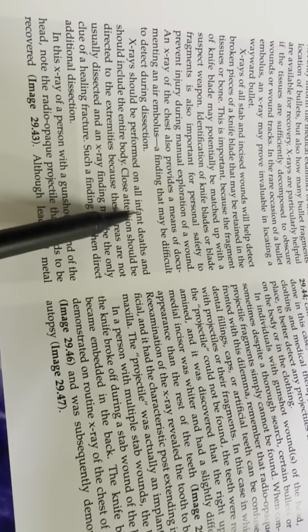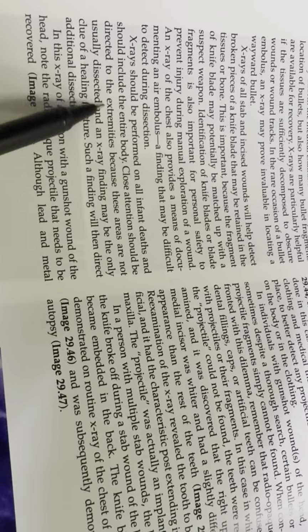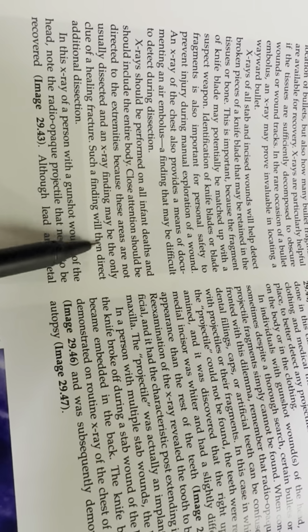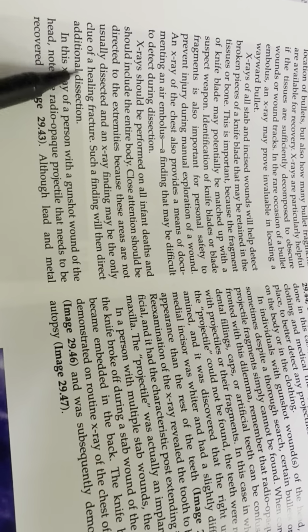X-rays should be performed in all infant deaths and should include the entire body. Close attention should be directed to the extremities because these areas are not usually dissected, and X-ray findings may be the only clue of a healing fracture. Such a finding will then direct additional dissection.